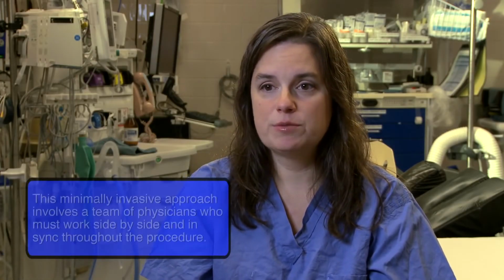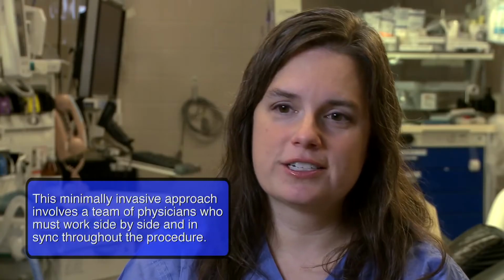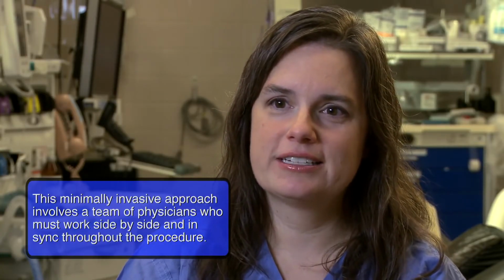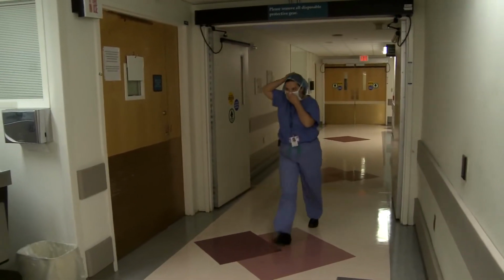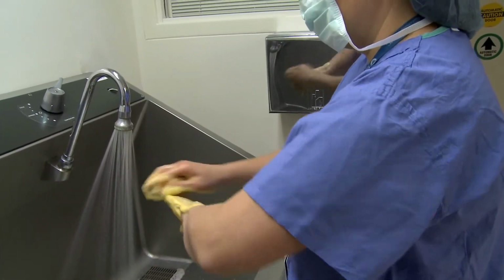What's pretty unique about doing the endoscopic orbital surgery at UPMC is we have a team approach, and we're very used to working together because we've worked together for years. The otolaryngologist's job is to do the sinus surgery and give us visualization looking laterally. The ophthalmologist's job is to orient everybody in the orbit and be able to identify what structure is what. And the neurosurgeon's job is to do a lot of drilling and to protect us from getting into the brain.